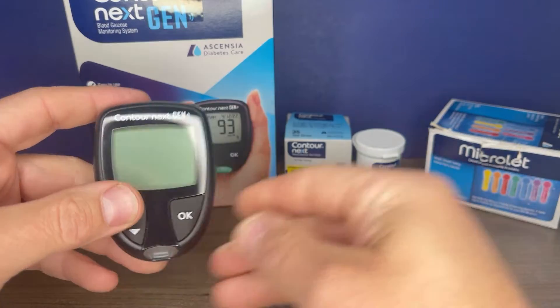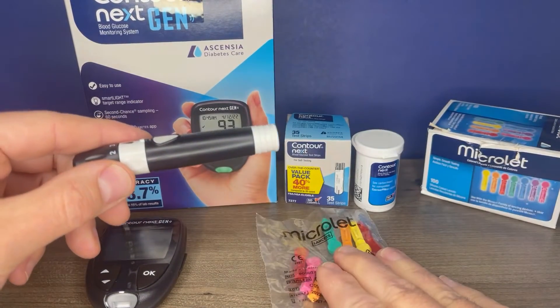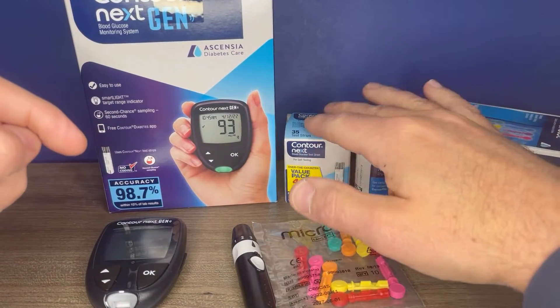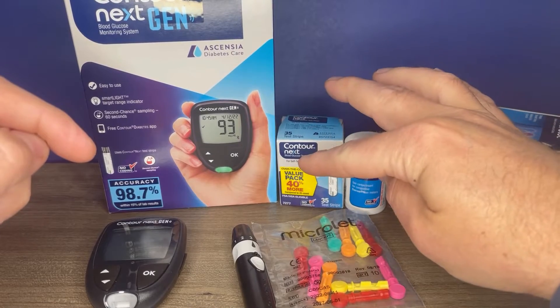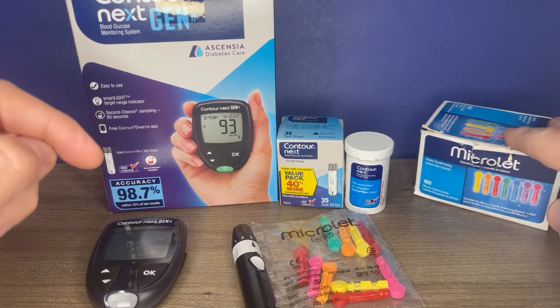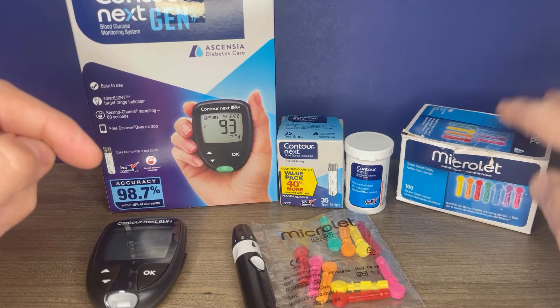Included in the kit, you will receive the monitor. The kit that I purchased had the MicroLet lancet device as well as ten MicroLet lancets to get started with. In addition to the kit, you will need to purchase test strips. Always ensure that they are the correct test strips for this meter. Additionally, you will need replacement lancets. We'll go over that a little bit more when we set up the lancet device.